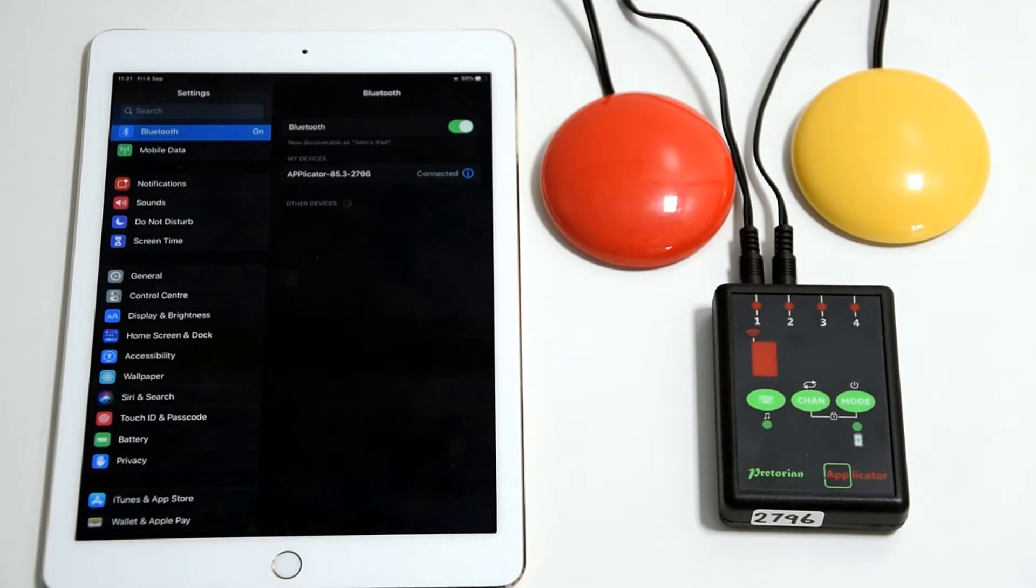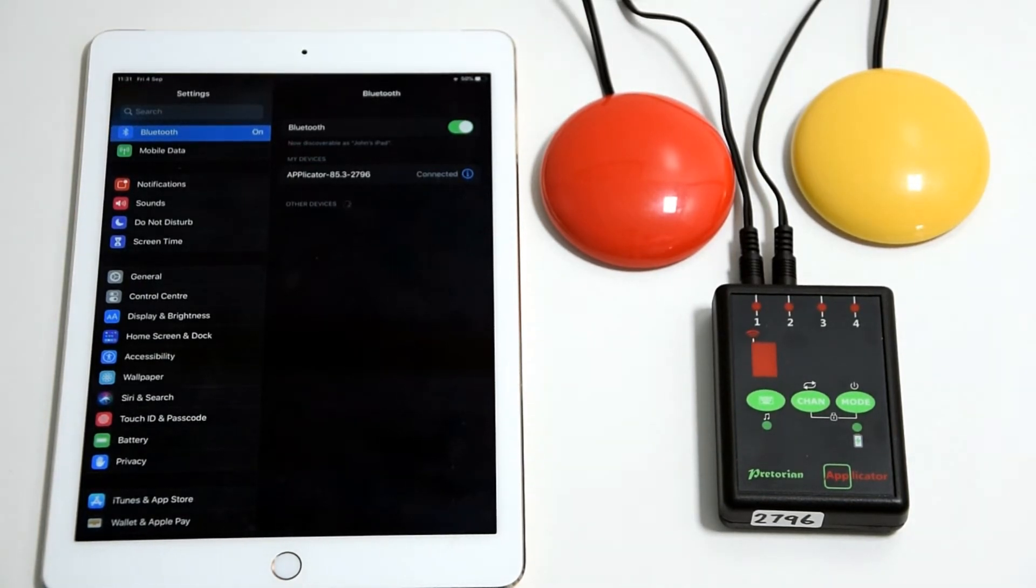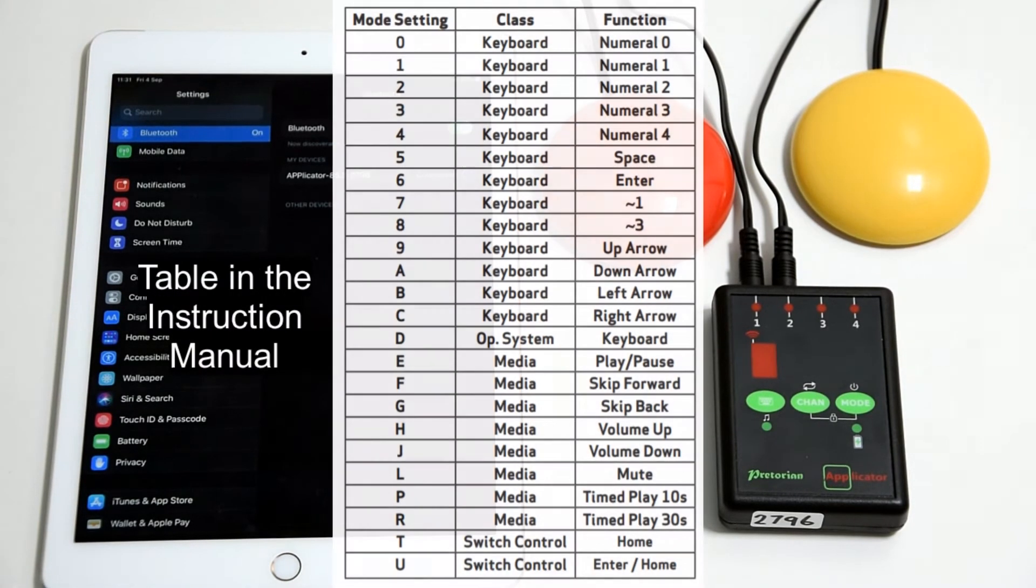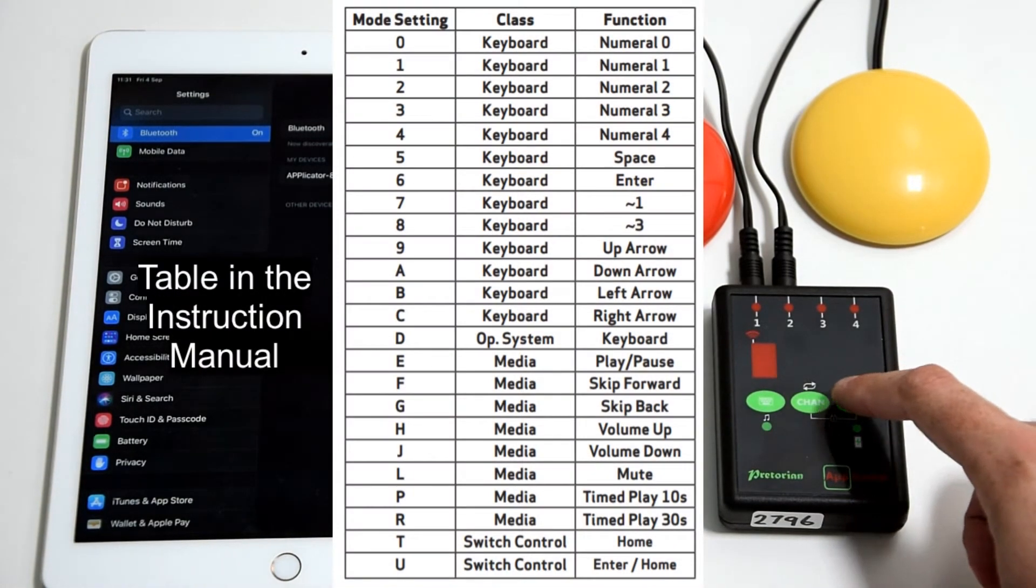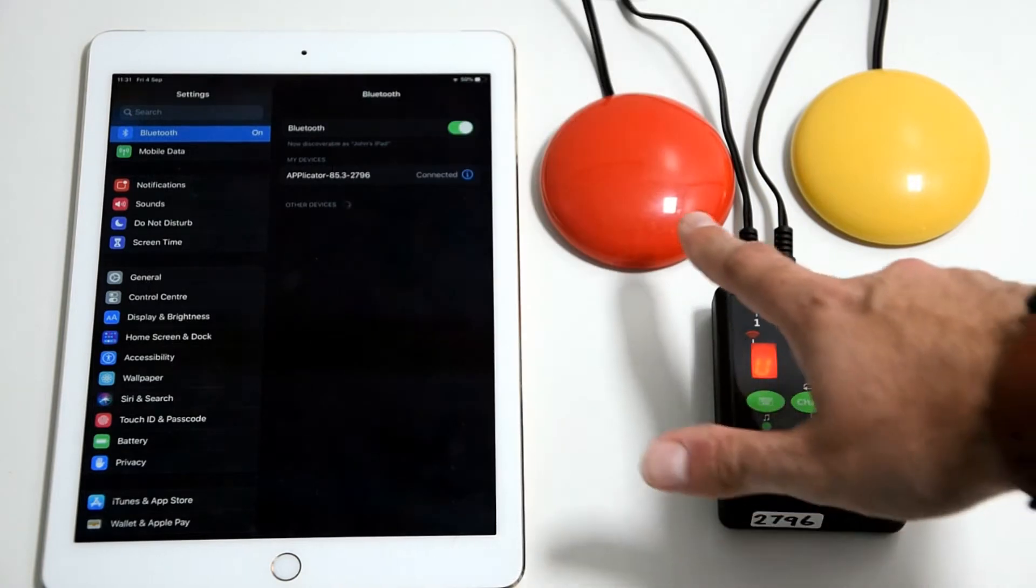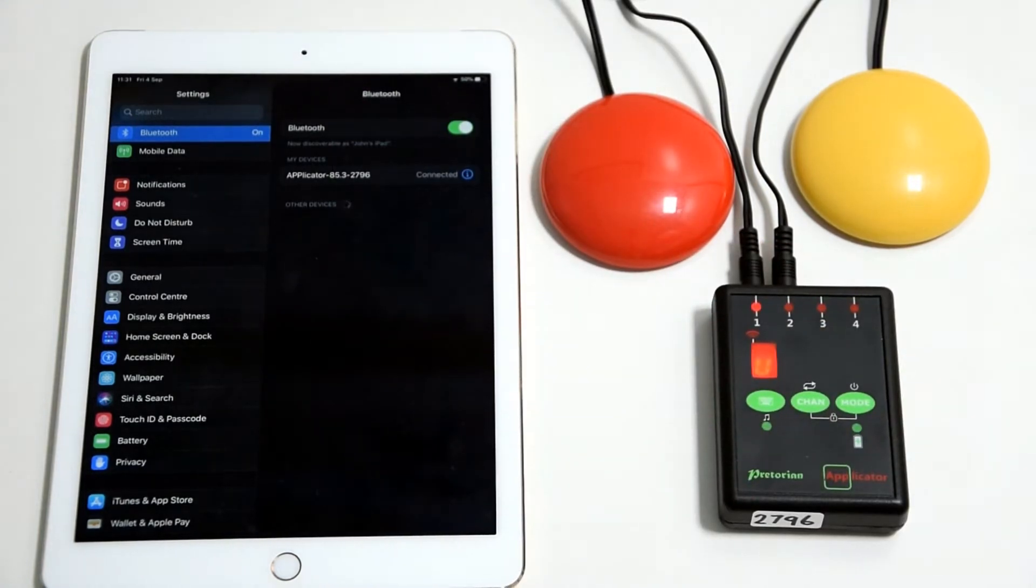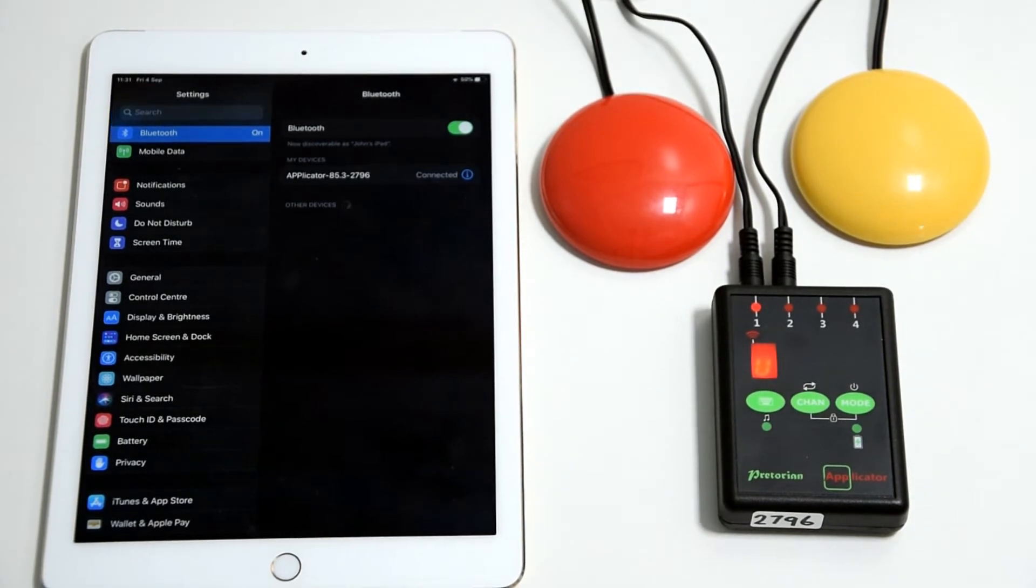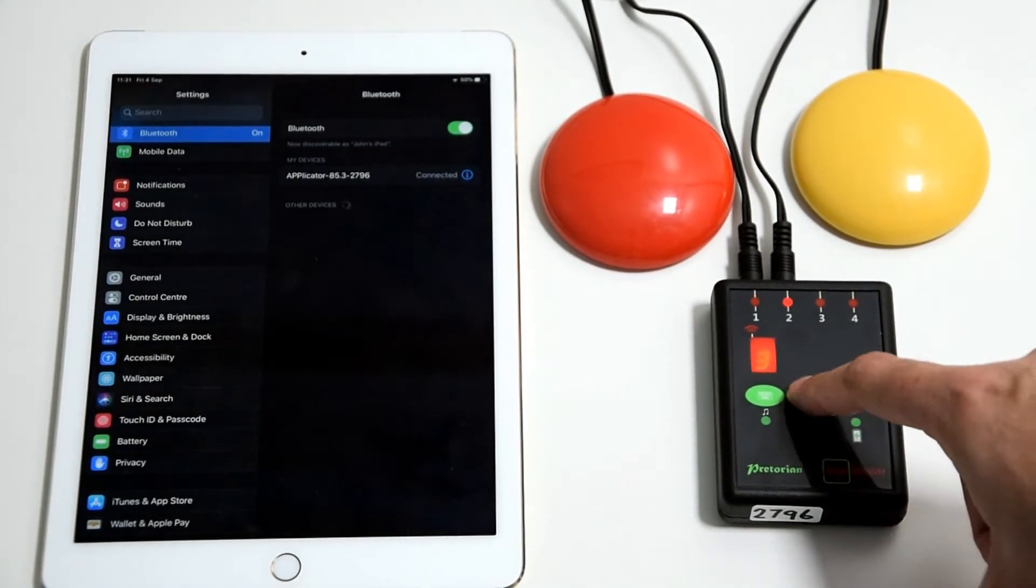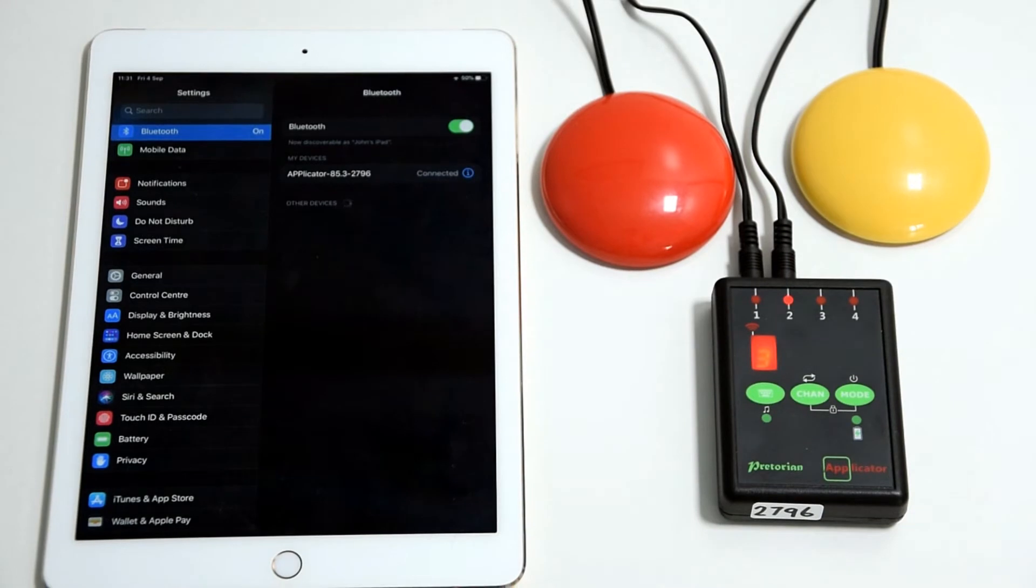For the sake of this introduction, I'm going to put it on a couple of standard options for you. By all means, have a look at the table and work out what you require from it, but for this I'm going to show you that channel one is in U mode, which is a double function for home or enter, and channel two we'll put into three, which is just one of the many numerical keyboard functions.